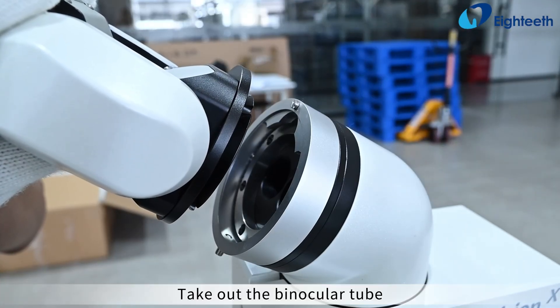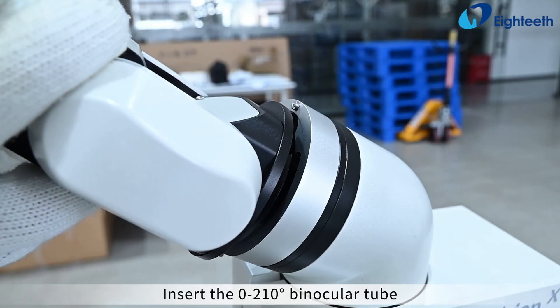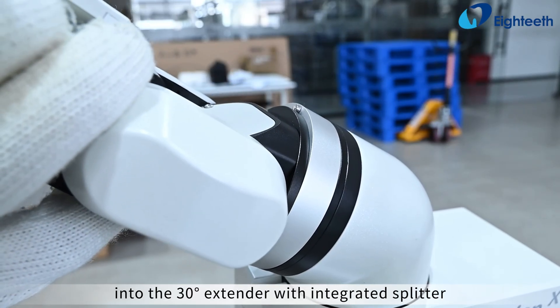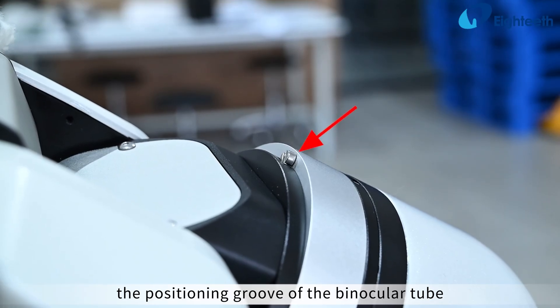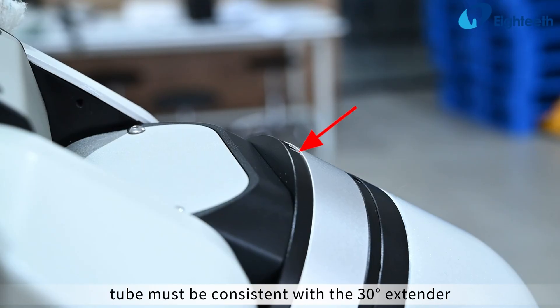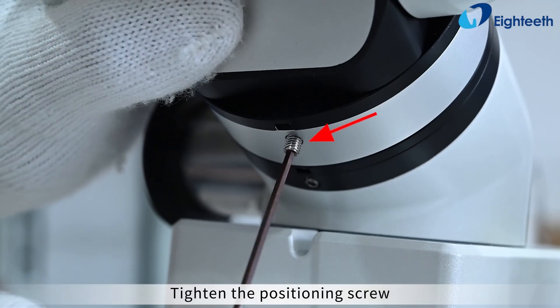Take out the binocular tube and loosen the positioning screw. Insert the 0-to-210-degree binocular tube into the 30-degree extender with integrated splitter. The positioning groove of the binocular tube must be consistent with the 30-degree extender with integrated splitter positioning pin. Tighten the positioning screw.